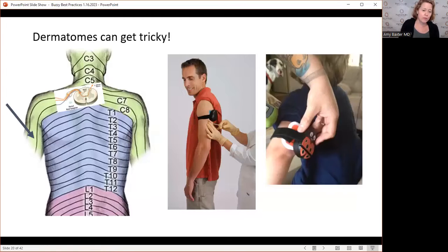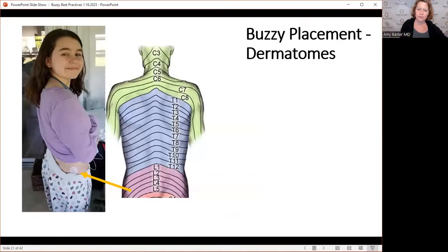For sub-Q, you're going to want to put it on the back. So any place in the area that's coming off of the back of the spine, around, again, for the arm, it's going to be pretty linear. And you would just want to slide it up a little before you do the insertion or the injection.